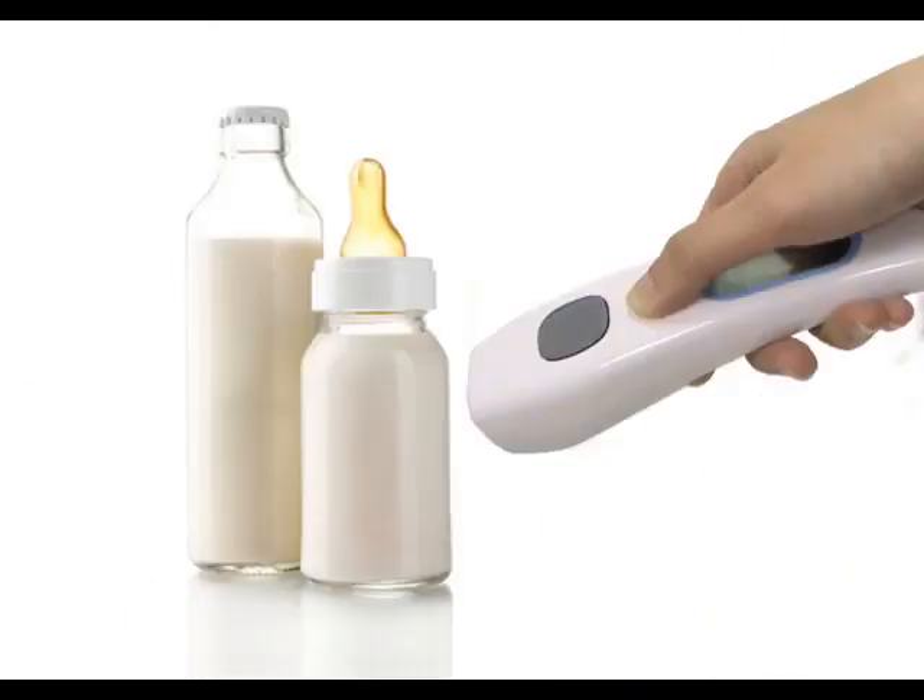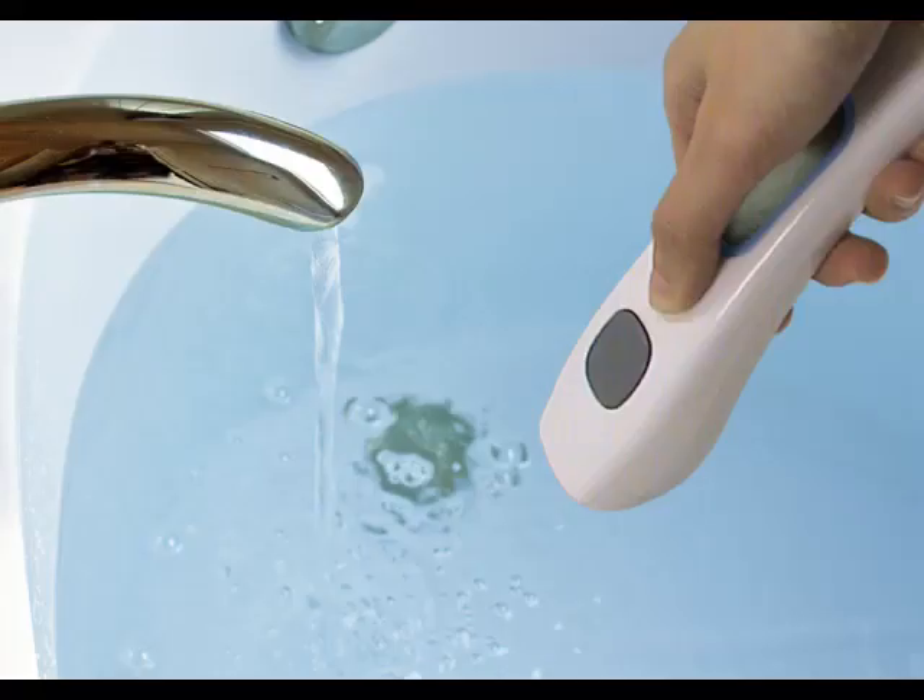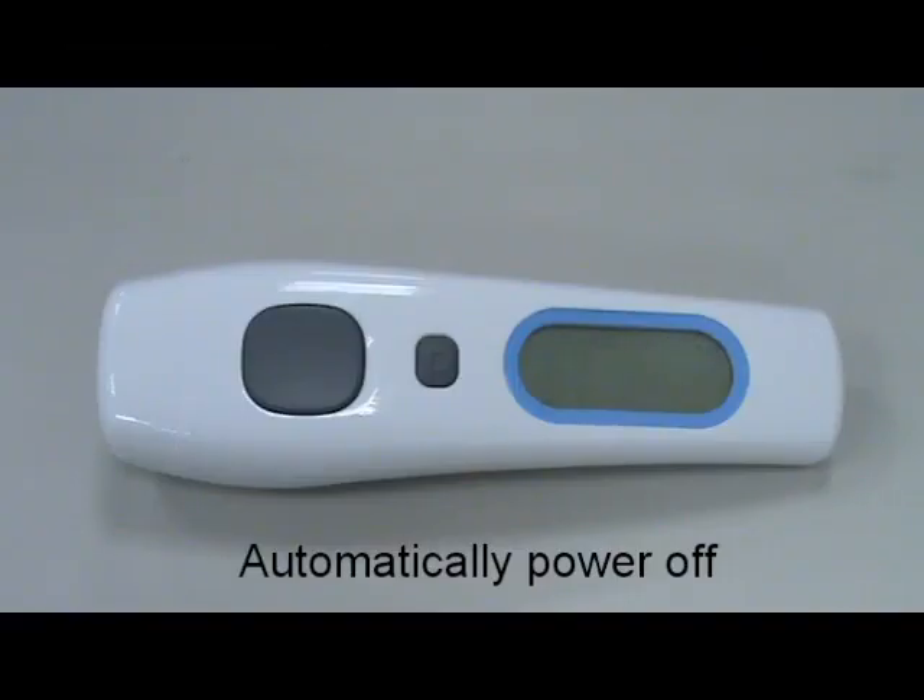Scan baby's milk or scan baby's bath water as examples. The thermometer will automatically shut off after 1 minute of inactivity.